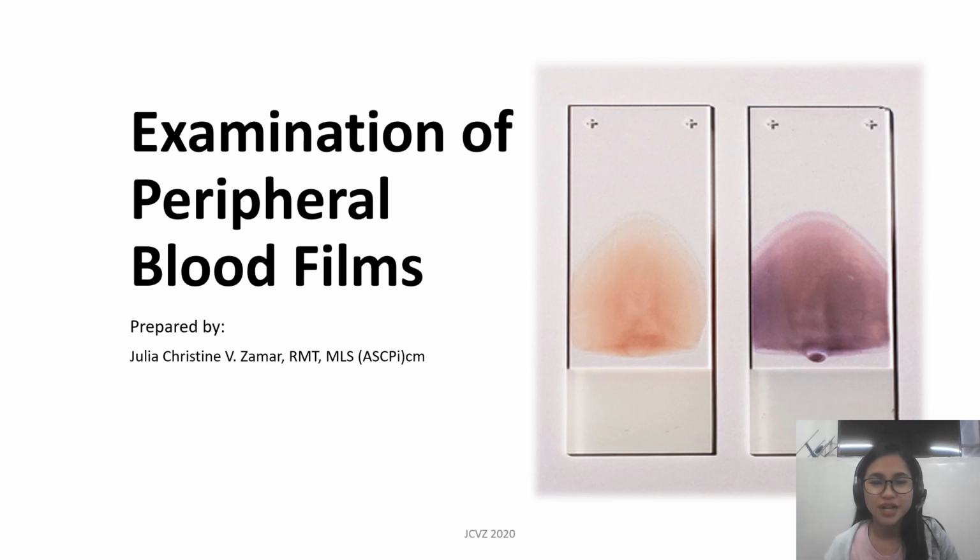Hi everyone, welcome to our discussion on Activity 5. Activity 5 is all about examination of peripheral blood films.